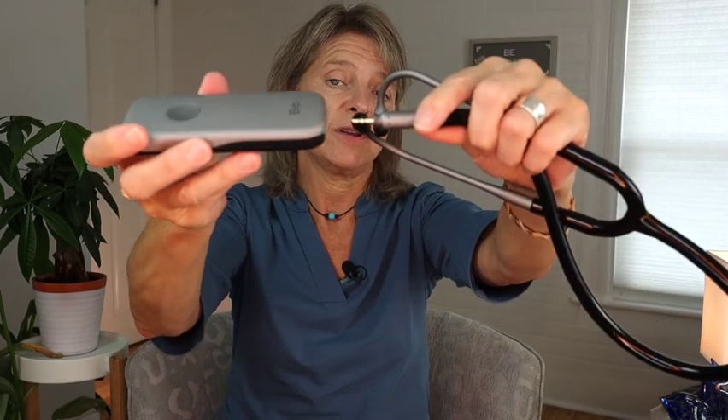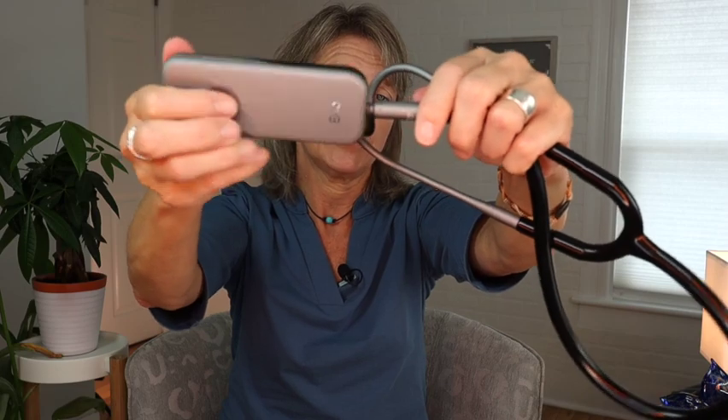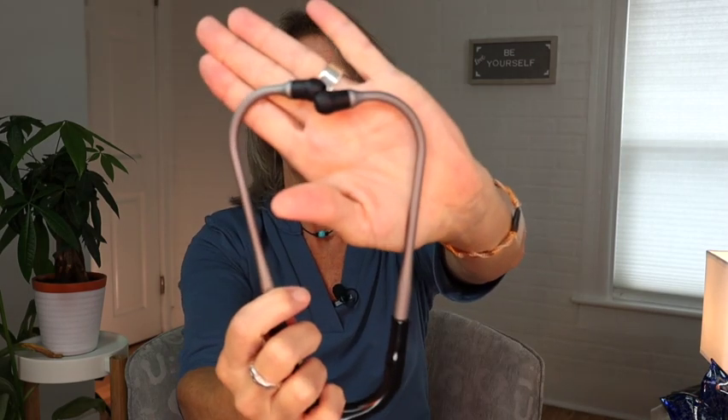I wanted to mention why I bought the tubing earpiece — I wanted to be able to hang it around my neck. When you connect this piece, you need to push it in and screw it on, not just push. Now that it's connected, I can put it around my neck like this. It looks a little awkward, but I like that the earpiece stays around my neck and never falls off. The other reason I bought it is so colleagues and students can listen to lung and heart sounds too. The box includes standard earpieces and more comfortable rubber-style earpieces as well.